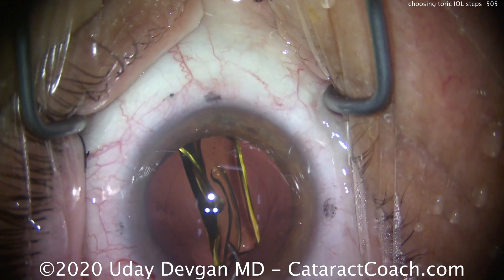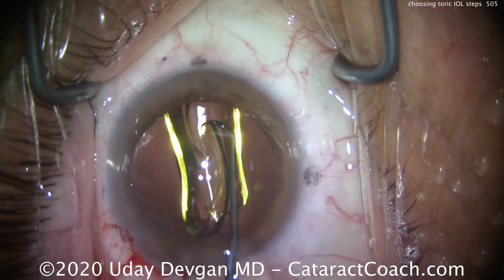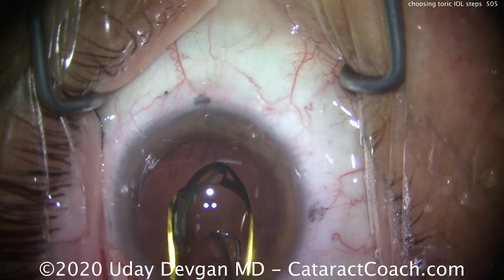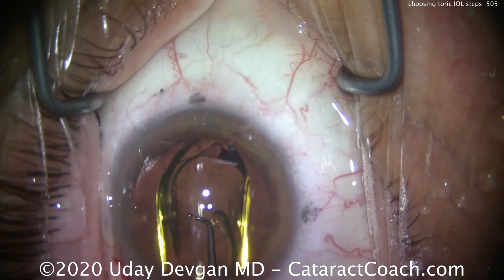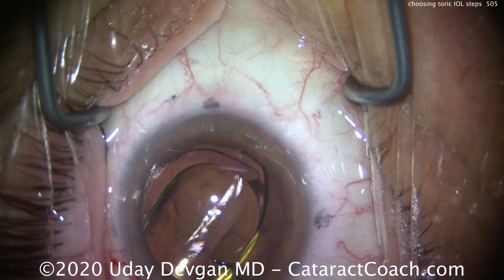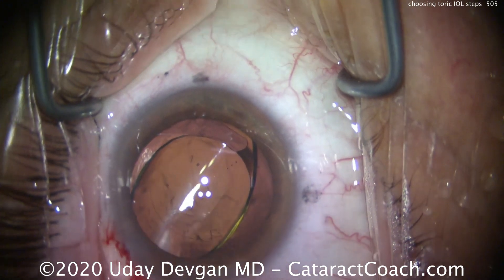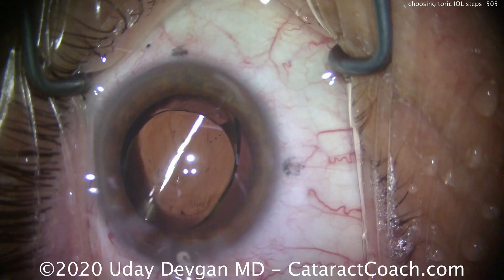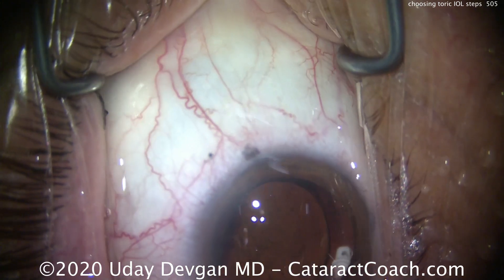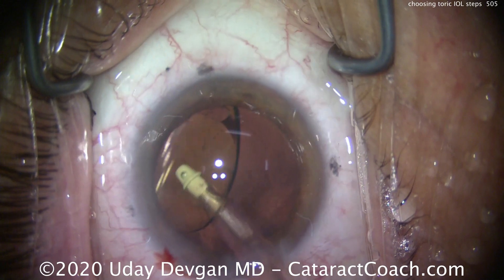There are online calculators that give you an assumption of what a typical posterior cornea looks like. For patients who have against-the-rule astigmatism, you tend to add and go up one toric step. For patients with with-the-rule astigmatism, you go down to a slightly lower toric step.